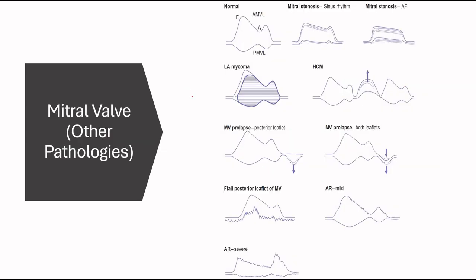This is mitral valve and other pathologies through the M-mode. The top three we already spoke about. In left atrial myxoma, the opening of the mitral valve is filled in with the mass. Here in HOCM, we have the SAM. In systole, the anterior leaflet mitral valve hits the septum.